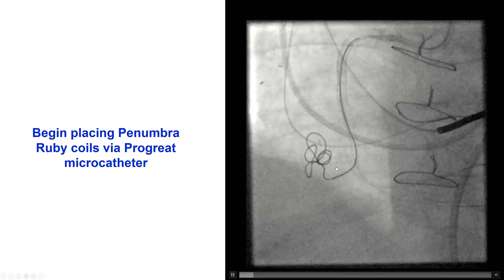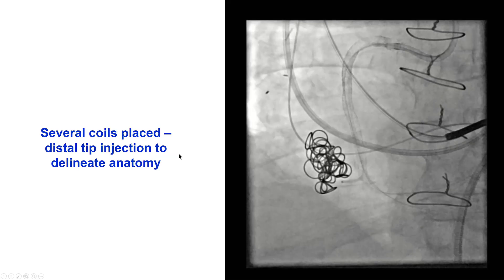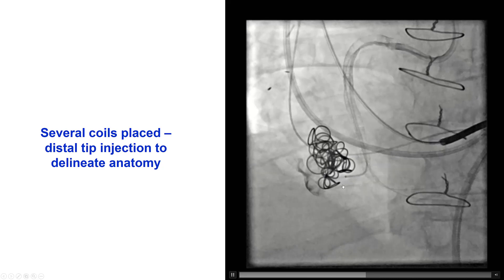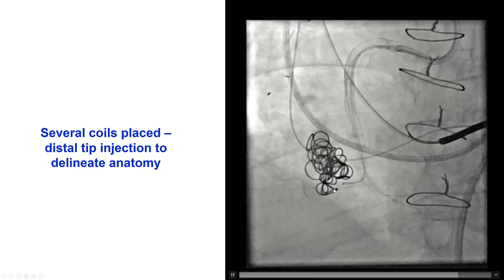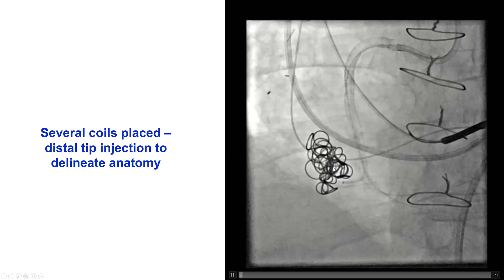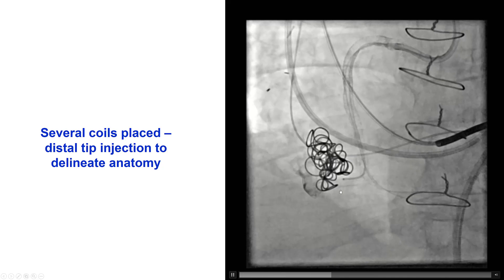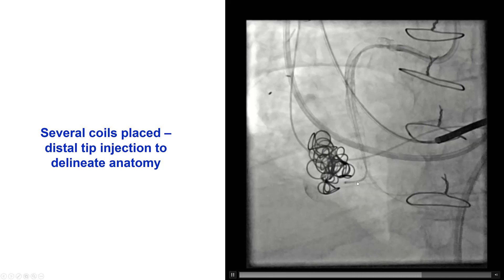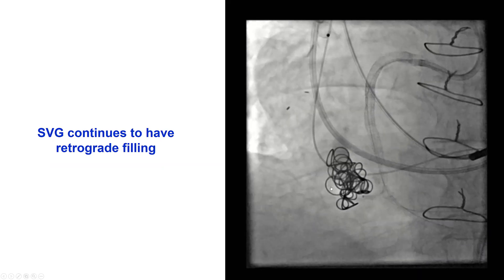As a result, we contacted interventional radiology, who were extremely helpful, and the decision was made to proceed with coil embolization. We inserted an antegrade microcatheter and then started placing penumbra coils. We did place several coils, trying to limit them to the portion of the saphenous vein graft closer to the distal anastomosis, but it was difficult to do so.